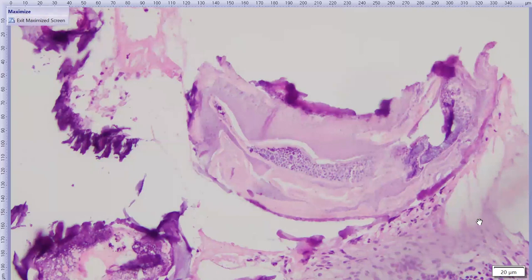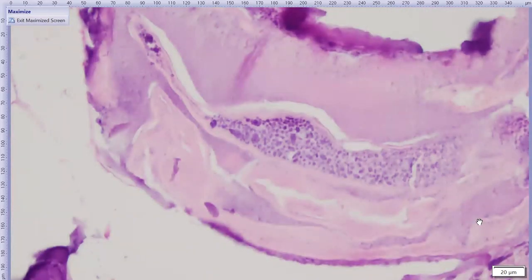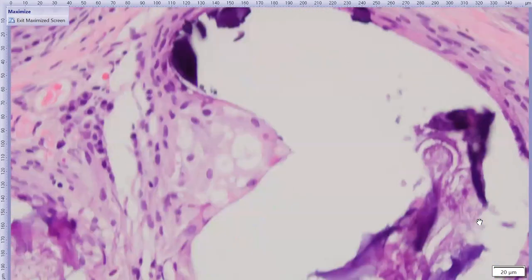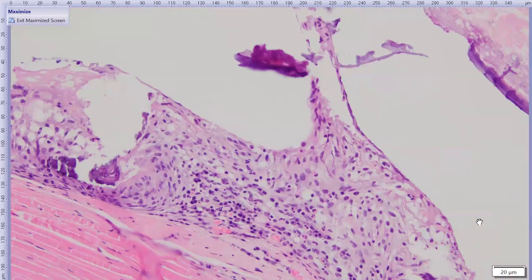with a granulomatous reaction. You can see there's the cuticle, and right here, you can see some degenerated organs, maybe some babies. The reason we know it's onchocerca, well, at this point it is an educated guess, because these are dead nematodes with a granulomatous reaction around.